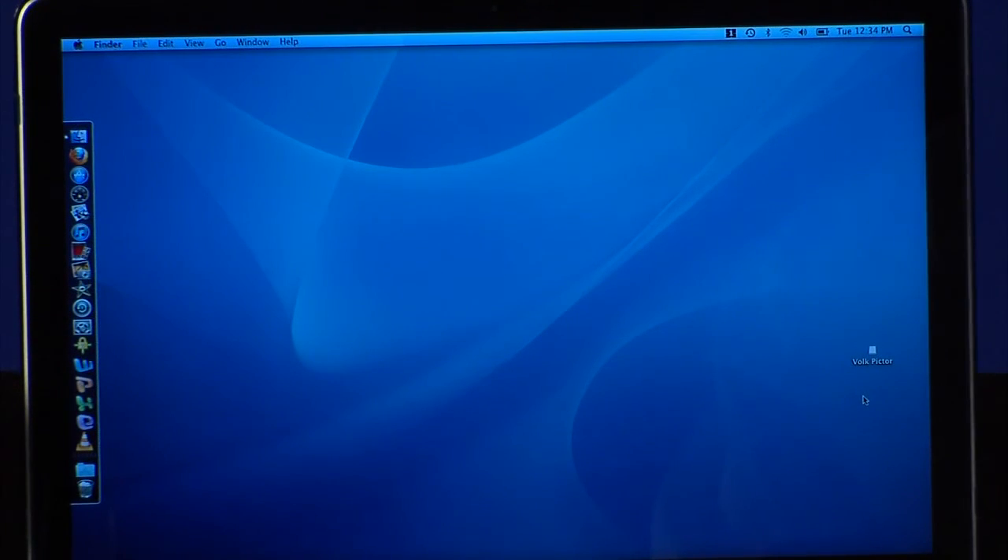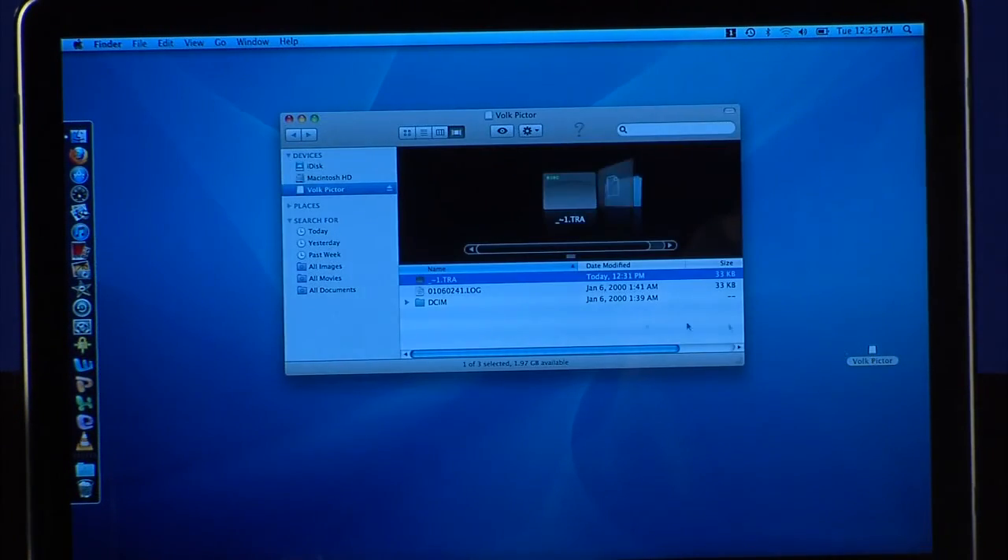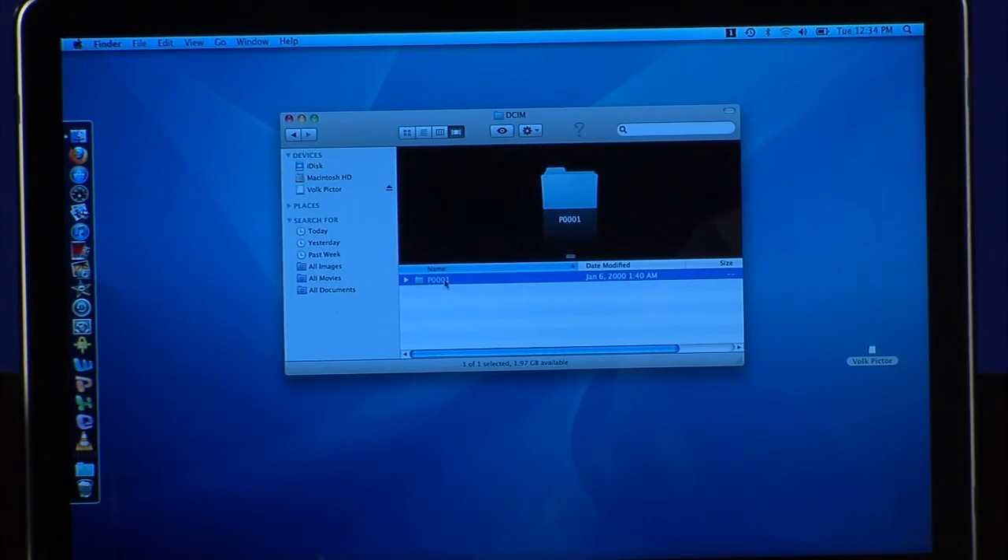Images will be transferred to the computer when the camera is placed in the cradle. Pictor works like any digital camera, creating a JPEG file. Locate the DCIM file and click to open.